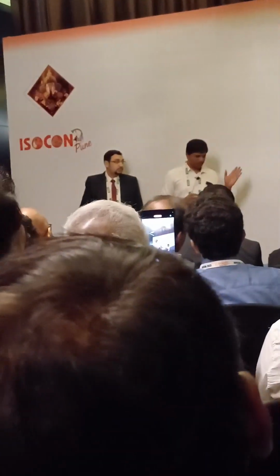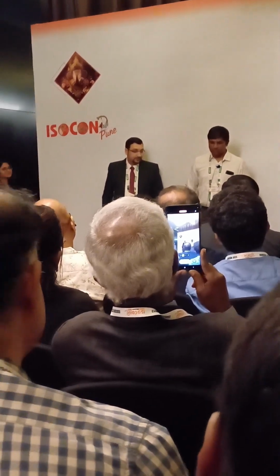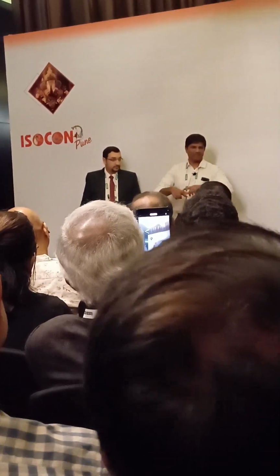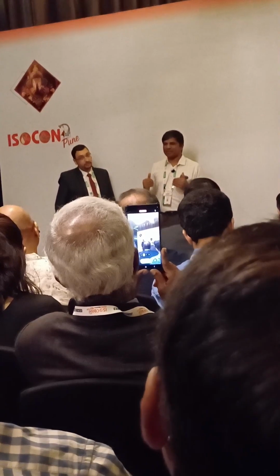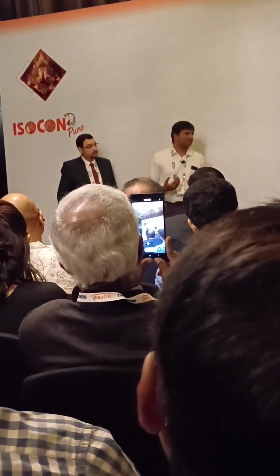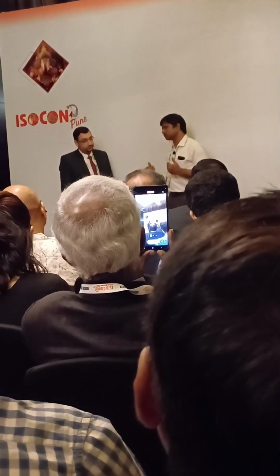You will come to Bangalore. I will give you foam. The minimum is 6 inches of foam, 60 centimeter by 60 centimeter wide. That is how the foam should be. On that foam, the person has to stand. These small things will teach a lot, will give us a lot of information. No vestibular clinic is complete without a foam.